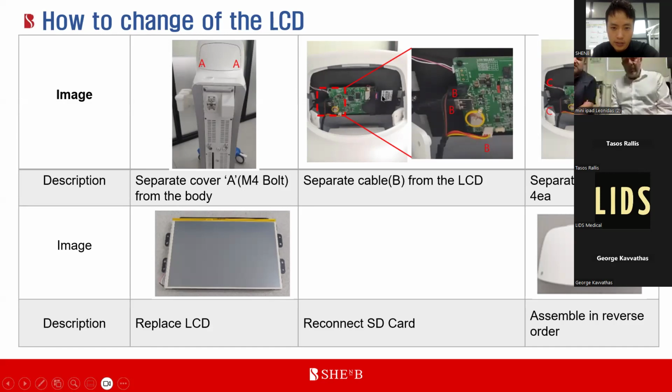And as I have told you, we can also find the SD card inserted on the LCD panel. This SD card is all about the user interface. So if there's anything wrong with the user interface, we have to check the SD card. Checking the SD card can also be done remotely. If there's any problem, I can send you the SD files, and then you can just copy the files into the SD card and reset it on the user interface. This is not likely to happen, because I have faced approximately one or two cases about this SD card.